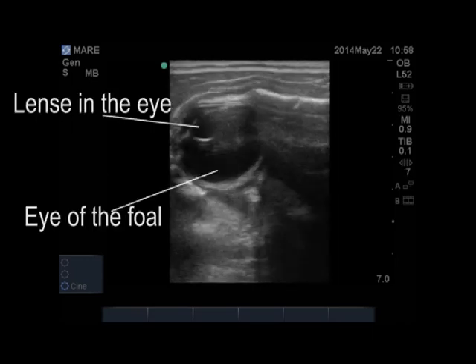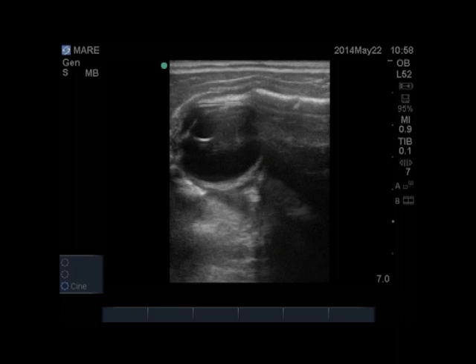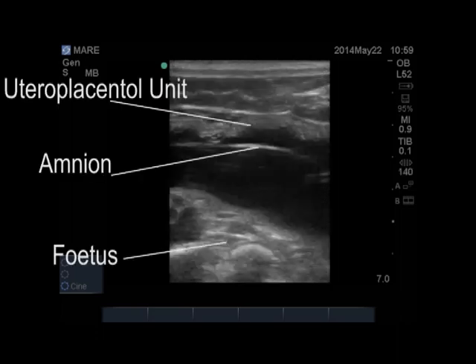This is just one of the images of the fetus, and in this picture you can see the eye very well shown — you can actually see the lens in the eye. Again, another one just of the fetus at the bottom, showing the utero-placental unit and the amnion floating around the fetus.